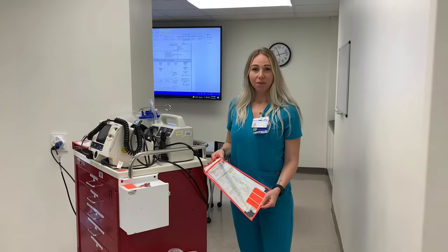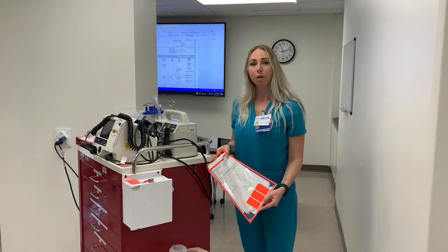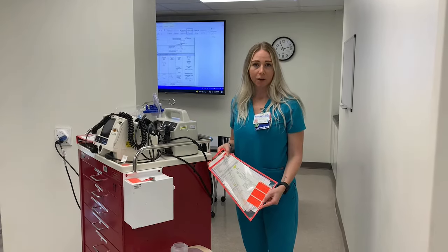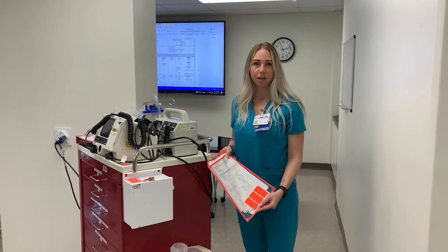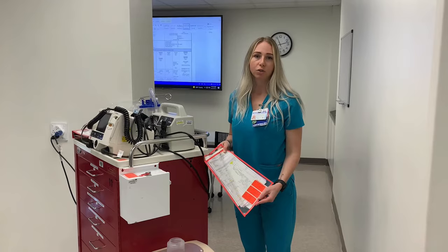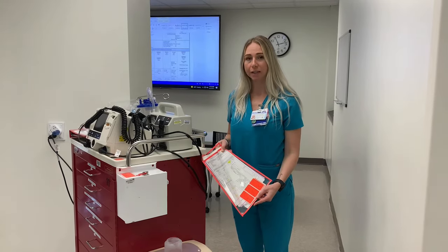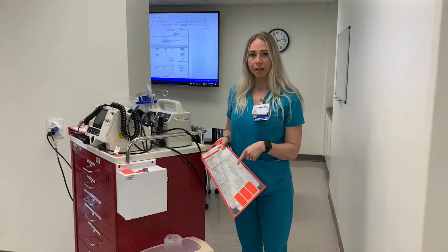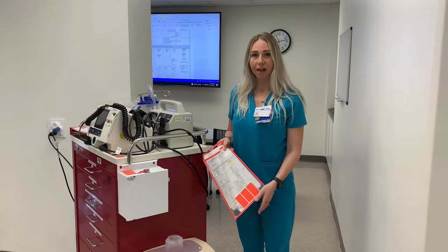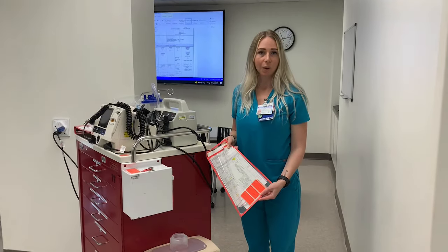On the back of the code cart we also have an extra packet that contains documentation. So if you run out or there isn't any in the binder, you can go back here and you'll see there are extra code sheets and also extra forms that can be filled out whenever you're checking the crash cart daily. Additionally there is a piece of paper that has all of the contents of each of the drawers on the crash cart if you're wondering what is in each one.